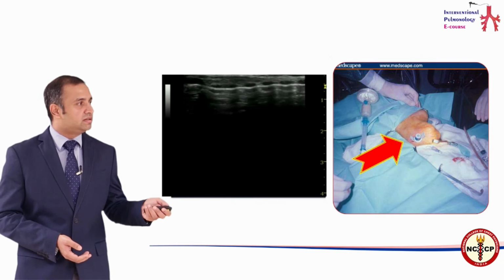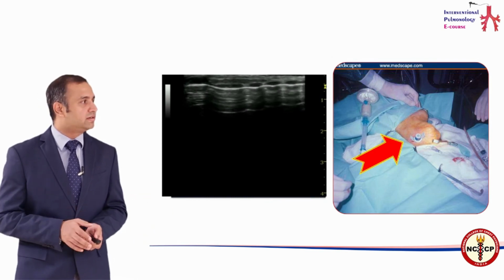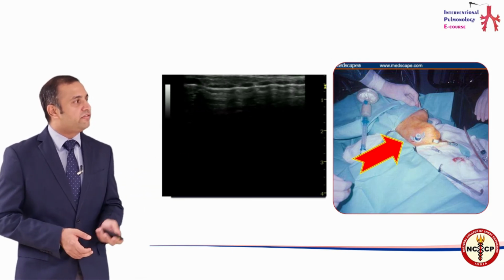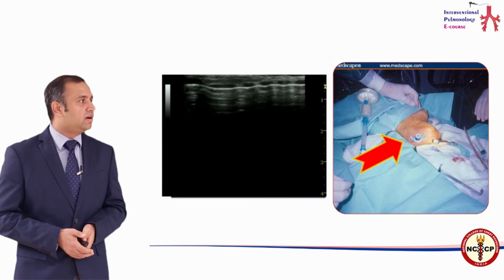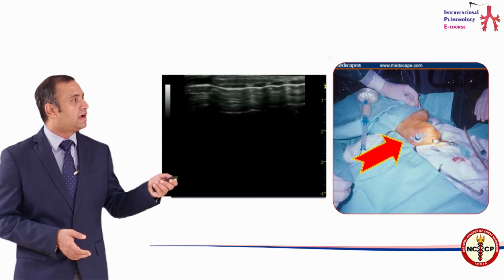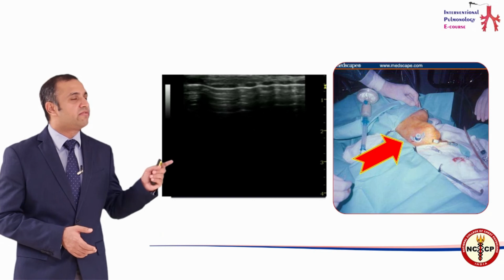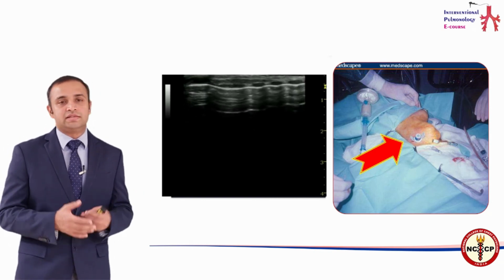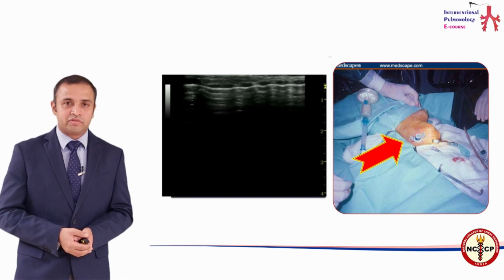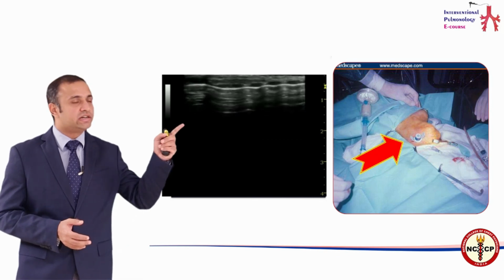As we can see in this patient, the airway has been grossly displaced, totally displaced to the right and lying somewhere on the side. And if we place the ultrasound probe along my trachea, I am going to be seeing this series of small black rings. These are the individual tracheal rings, and the bright white line beneath the tracheal rings is the air tissue interface. As I told you in the previous part of the talk, air produces bright white artifacts. So, there you can see the continuous air artifact.